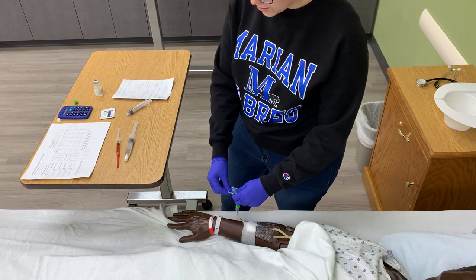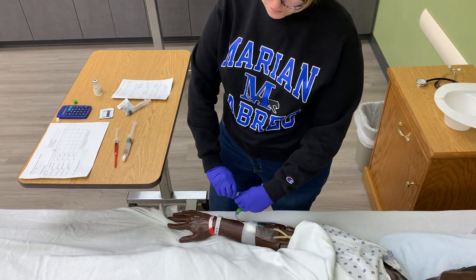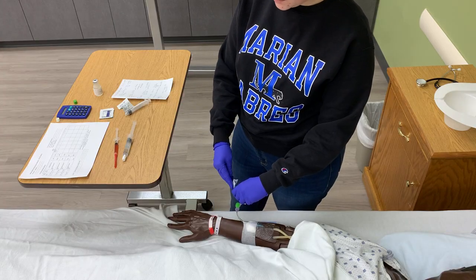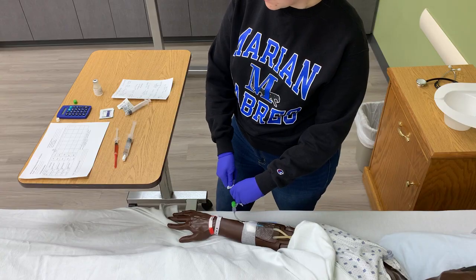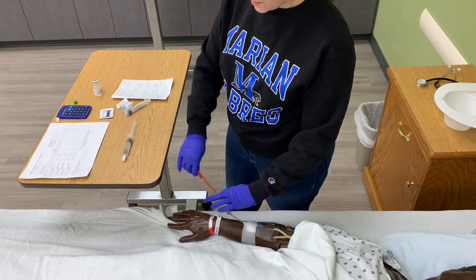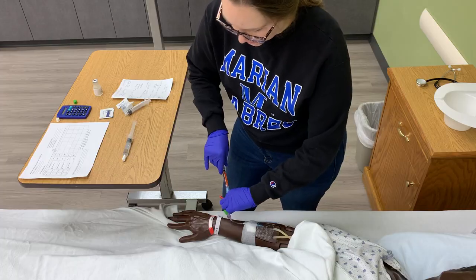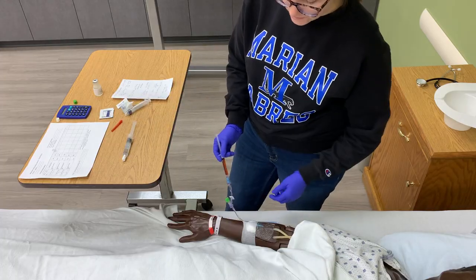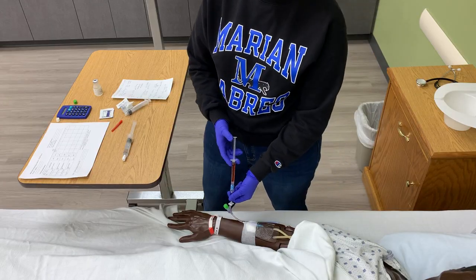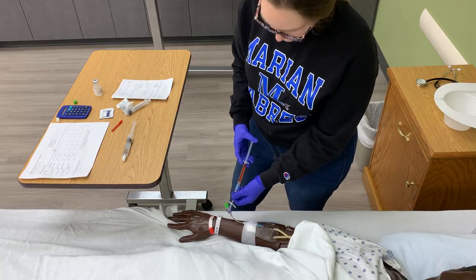I'm going to alcohol the clave before I connect my furosemide. So cleaning for 10 to 15 seconds. Okay, then we're going to aseptically connect our furosemide syringe, and I changed this to some red so that you guys are able to see better. So based on our calculations, we're pushing 0.3 mLs every 15 seconds. Each one of these lines is 0.1 mLs.